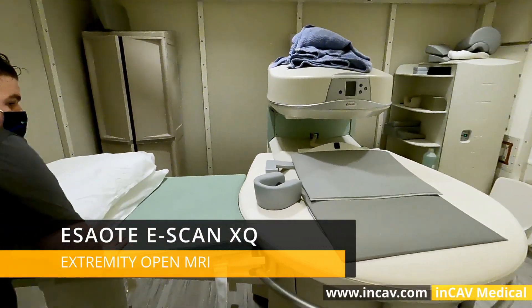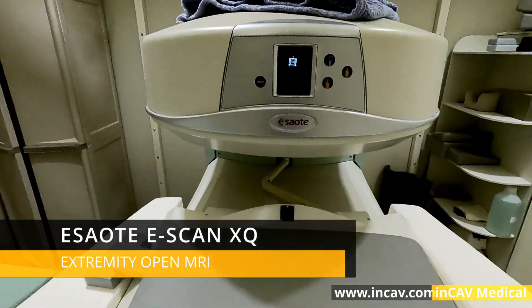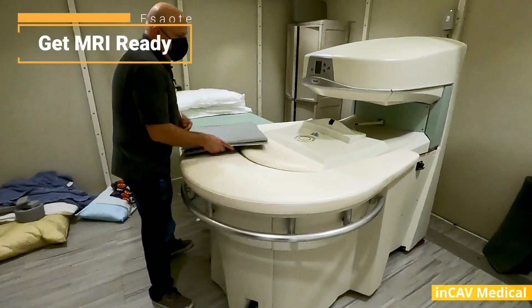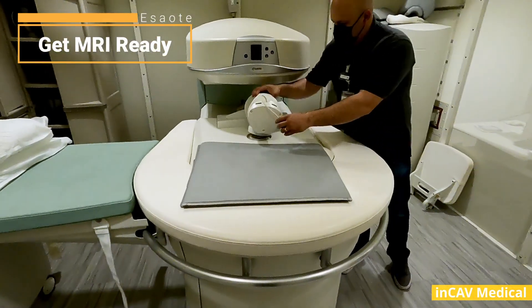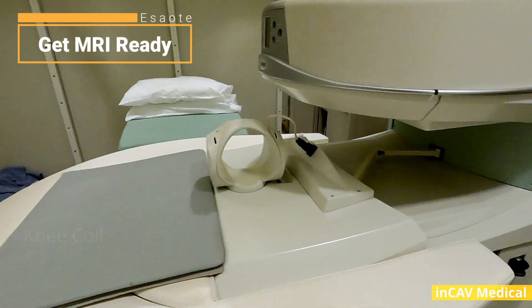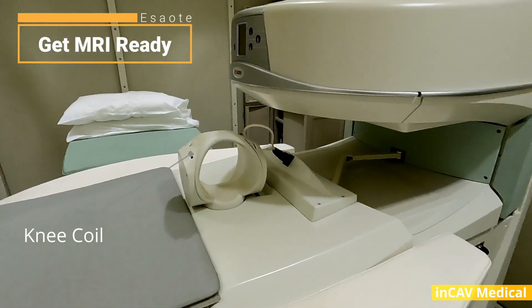This is a 0.2 tesla MRI. Today we are going to make a left knee study with a young patient. First we need to prepare the MRI and choose the right coil for the study. In this case, it will be a knee coil.